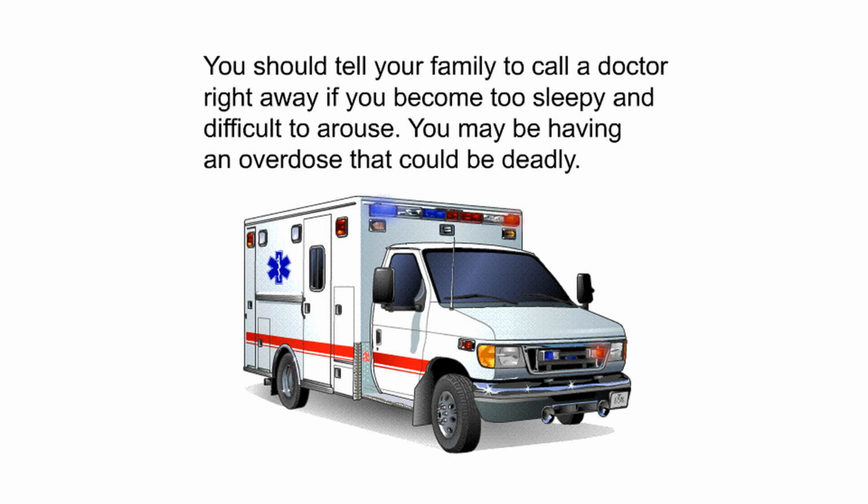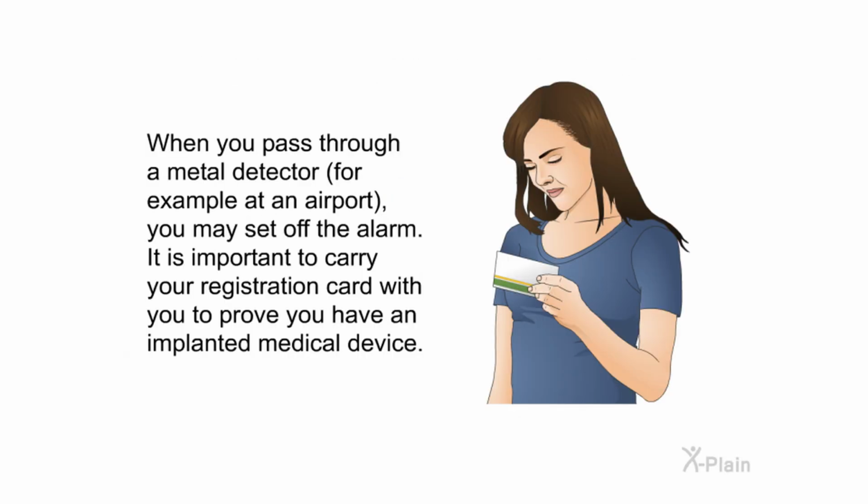You should tell your family to call a doctor right away if you become too sleepy and difficult to arouse. You may be having an overdose that could be deadly. When you pass through a metal detector, for example at an airport, you may set off the alarm. It is important to carry your registration card with you to prove you have an implanted medical device.